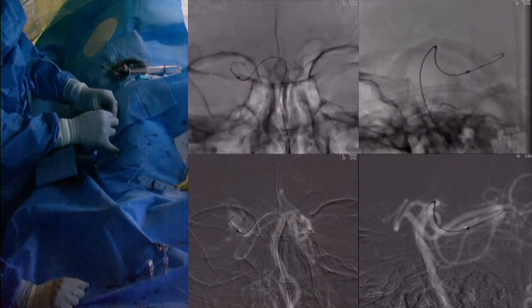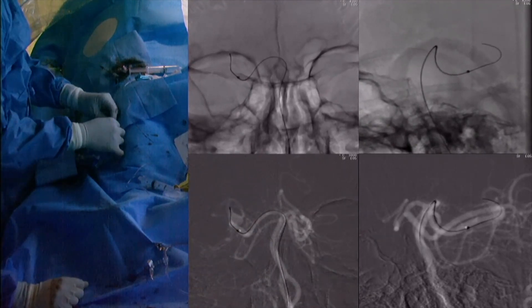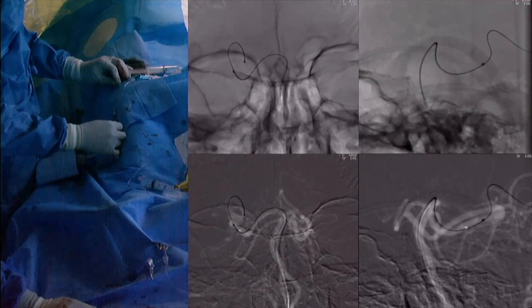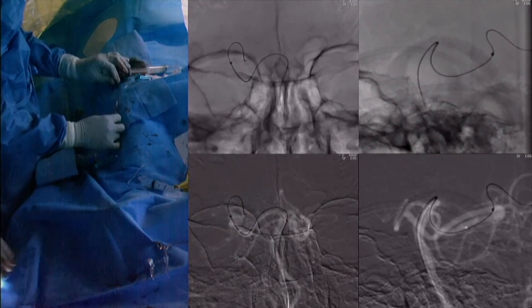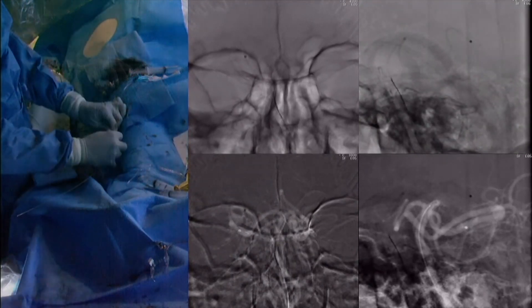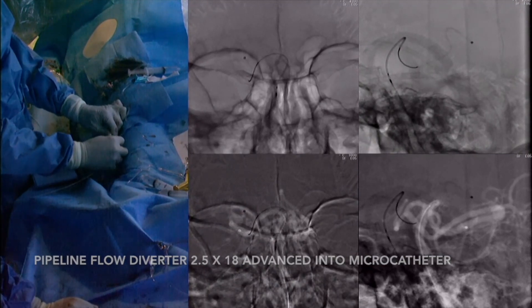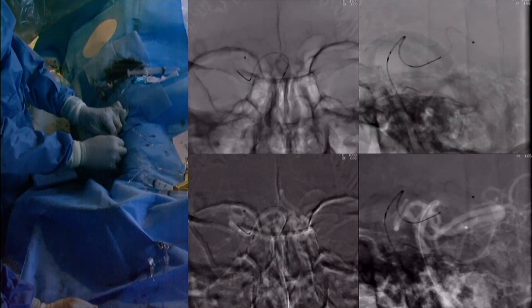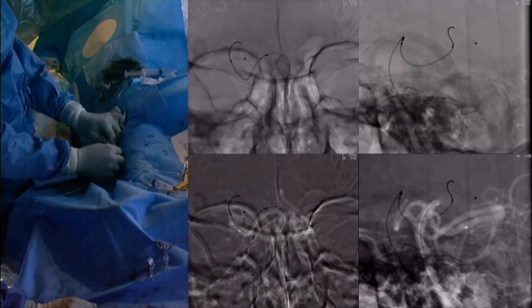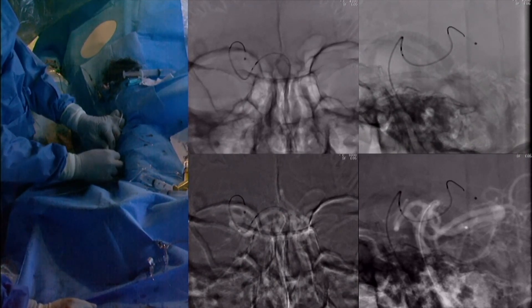Once we access the posterior cerebral artery, we navigate the wire across the aneurysm and obtain distal purchase in the vessel. It is critical to get the wire distally in order to navigate a large microcatheter through the aneurysm into a distal landing zone. Once we have significant distal access with the 027 microcatheter, the flow diverter is then brought into the microcatheter and is deployed distal to the aneurysm. We allow a significant distal landing zone in order to prevent the flow diverter from herniating or collapsing back into the aneurysm.